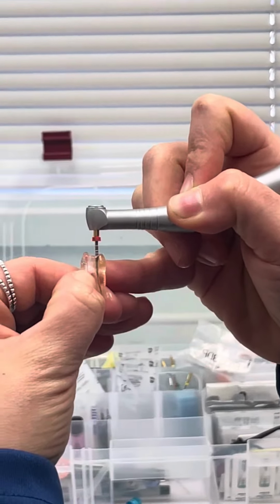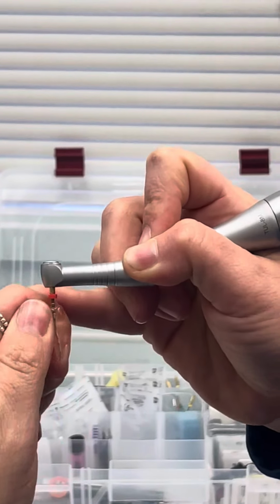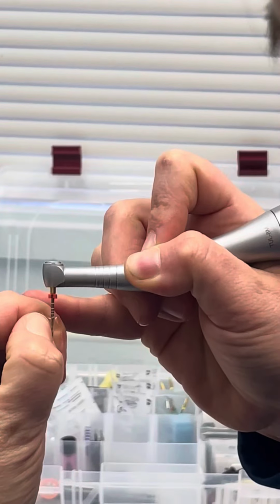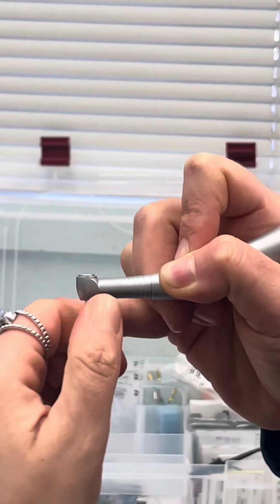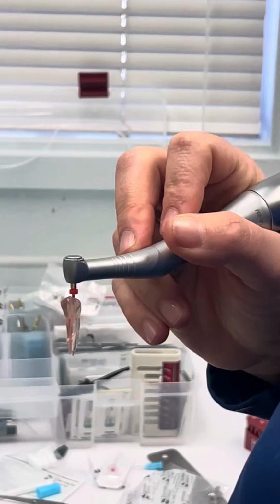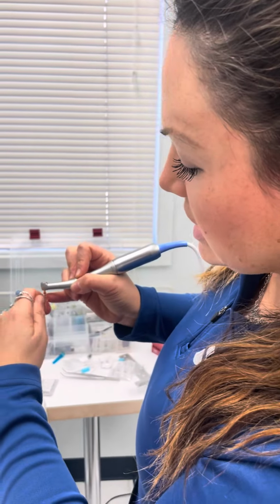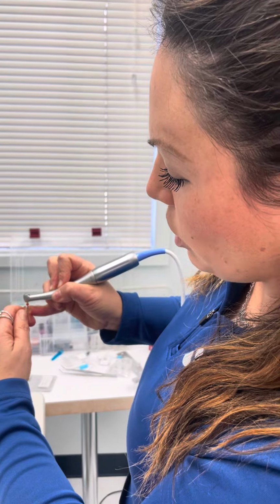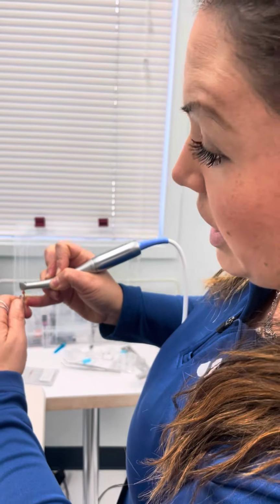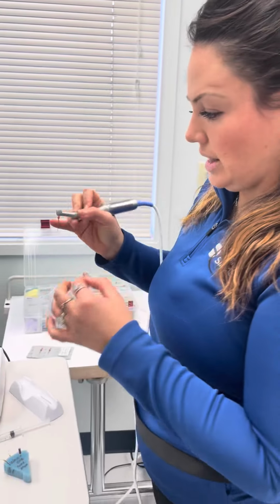So now I'm going to go down to my 20 reference point of my lingual. And I'm just going to, and see that noise? I kind of try to force it. That's your secondary insurance plan. That noise is going to say, ooh, too much stress, and it's going to auto back out. So if a doctor does that and he's in a situation where he can't remove it, like me right now since it's so slippery, I'm just going to go to reverse and it'll slide right out. Okay? No stressing the canal.